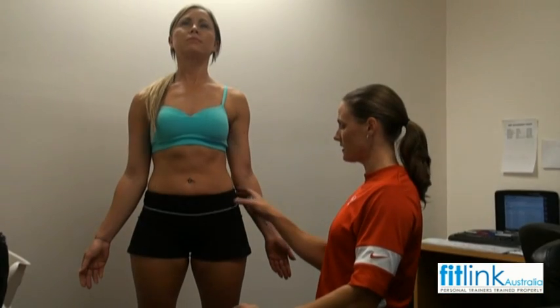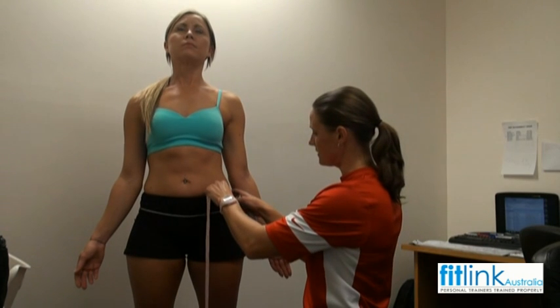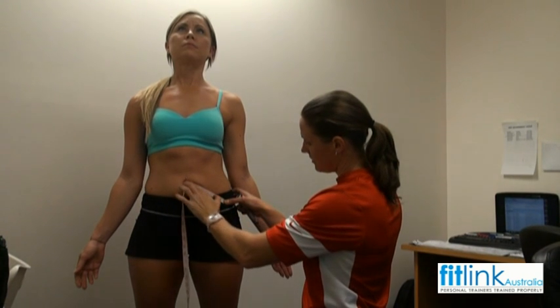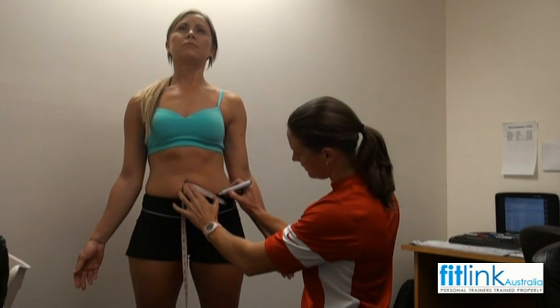And placing a mark. Now for the super iliac — measuring from the top of your hip bone here, placing the tape measure from the top of your hip up to the belly button, measuring across four centimetres, and placing a mark.